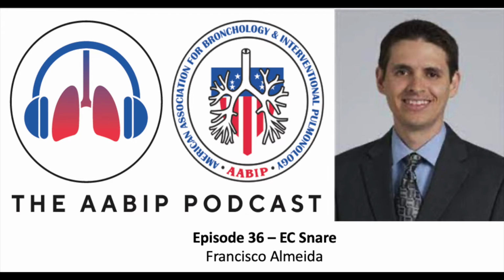Perfect. So we all know that electrosurgery plays an integral role in the management of malignant central airway obstruction. And we know that in terms of contact electrocautery, we have various devices at our disposal. We have the Bowie, we have the electrocautery knife, the electrocautery snare, which we'll talk about today, and some newer devices such as the Coag, which is marketed by one of the companies. So when you are deciding about using electrocautery snare for patients, is there a specific lesion characteristic or a type in which you use this as a go-to tool when you're managing these patients with central airway obstruction?